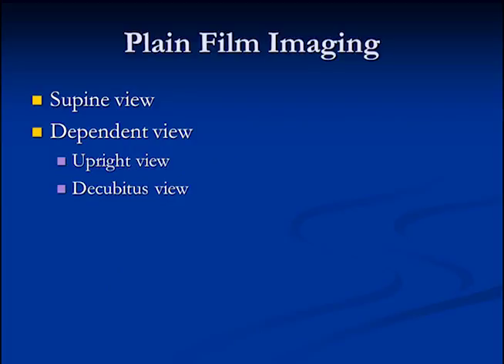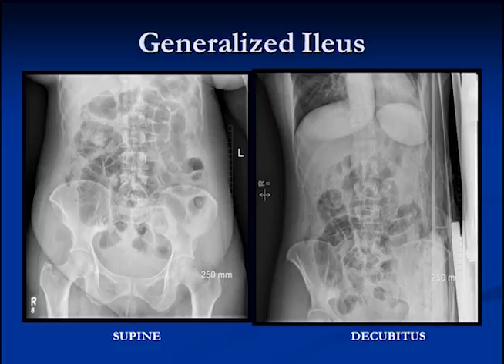When imaging the abdomen, we're going to do a supine view and two dependent views — upright and decubitus, or either one. Whenever you do plain film imaging, you should try to get a dependent view as well. This is an example of a generalized ileus — we've got air everywhere in the bowel, large bowel and small bowel, only mildly distended. On the supine and decubitus views, the patient is laying on a side right side up, so if there's any free air we can see it lying adjacent to the liver. We've got loops of large and small bowel with no air-fluid levels at all, so this is a generalized ileus that will clear up on its own.